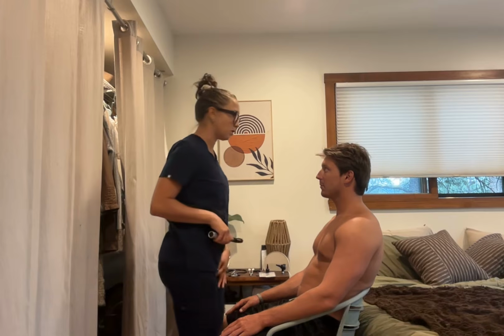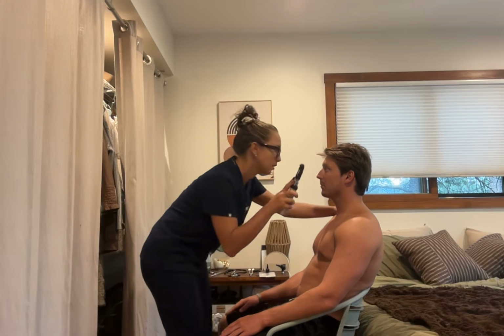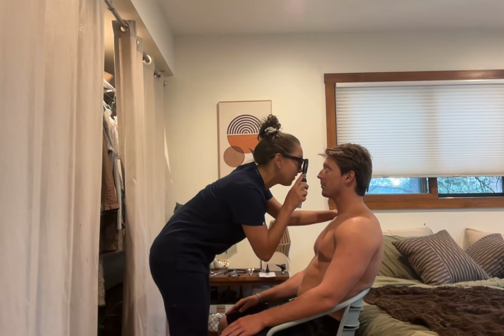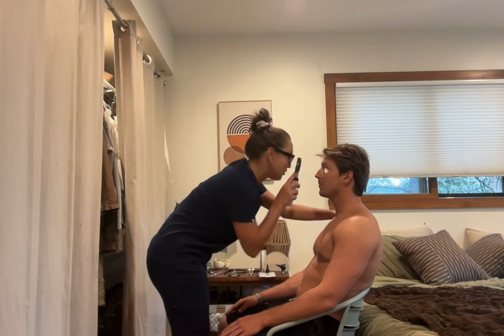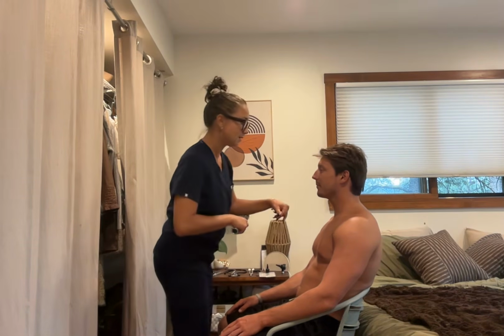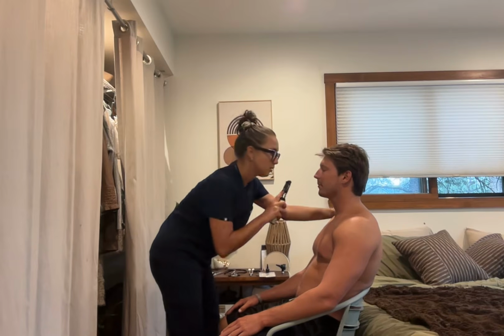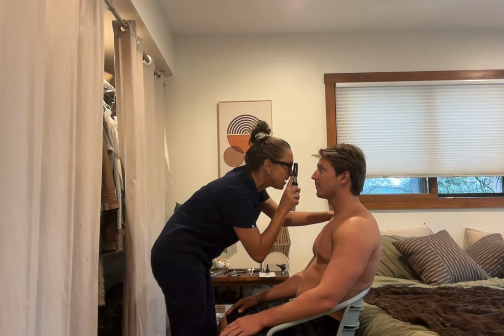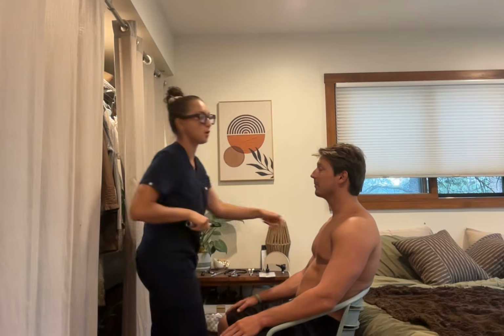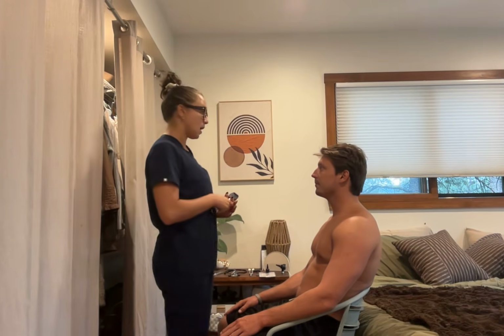Now I'm going to look a little bit closer and looking for a red light reflex, and it is moving in. Look straight at the light, can see the macula, the optic disc, and that is at a 1:3 ratio. Great. All right, now I'm going to have you look straight ahead. Good. Red reflex present. Able to see the macula, optic disc. Good. Orange, yellow on both sides for the optic disc. Good.